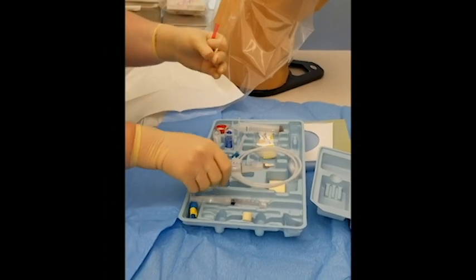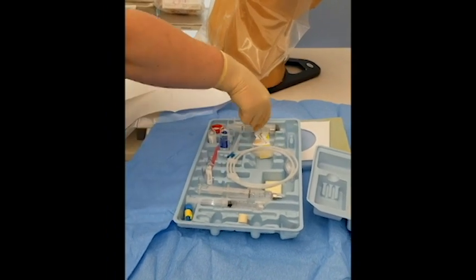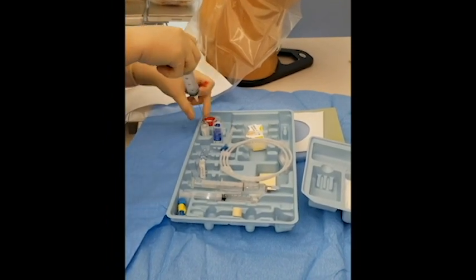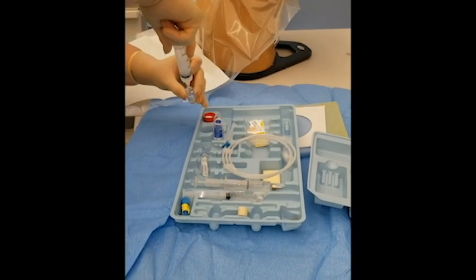Go ahead and unwrap your epidural catheter, uncap your Tuohy needle, and prime the adapter with your test dose, if applicable. This will save time during your insertion.